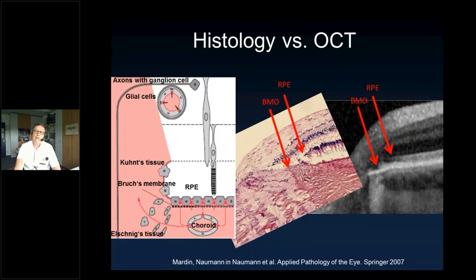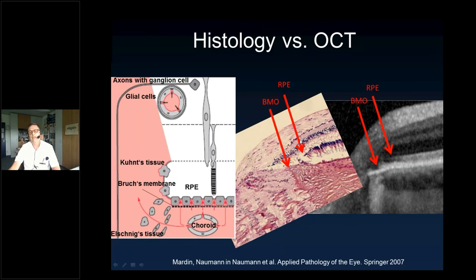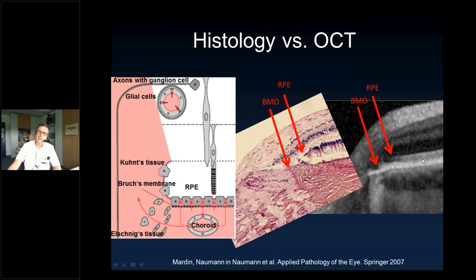OCT provides very high resolution. In this one-to-one comparison between in vivo OCT and histology — after removing the eye due to malignant melanoma — you can nicely see all anatomic structures visible in histology: the retinal pigment epithelium, the edge of the scleral rim, the ending of Bruch's membrane, the nerve fiber layer, neural rim, and all retinal layers including ganglion cell axon thickness, choroid, and RPE ending.